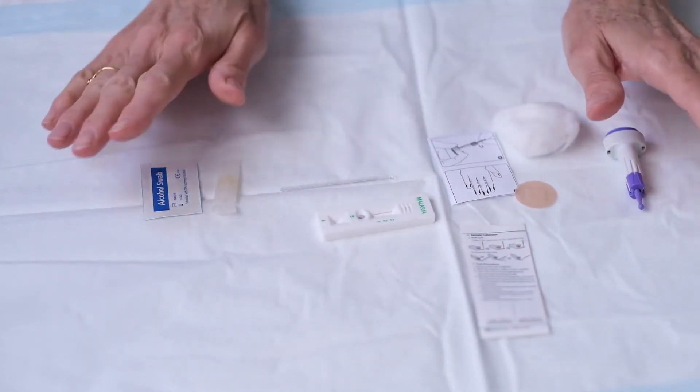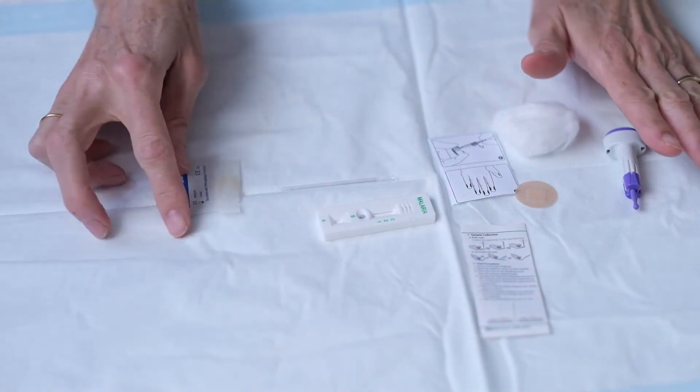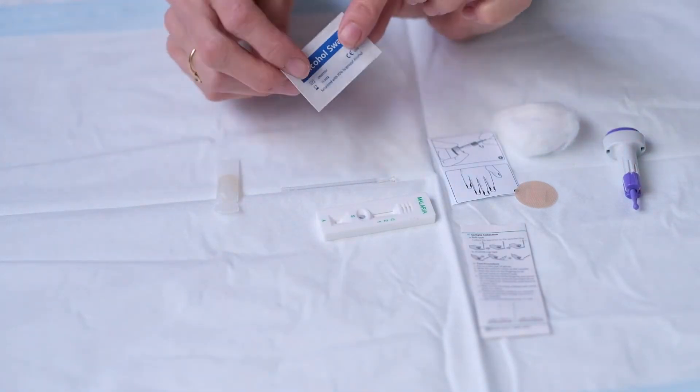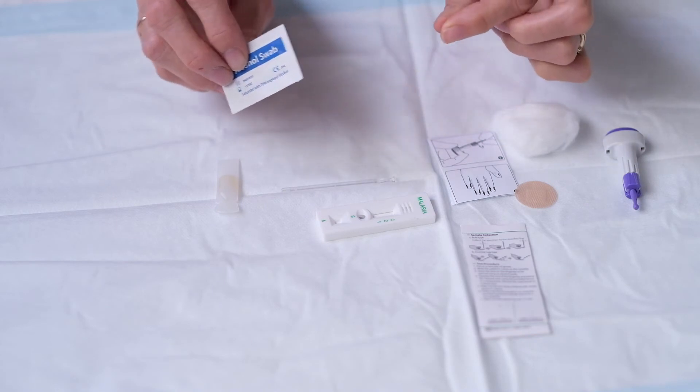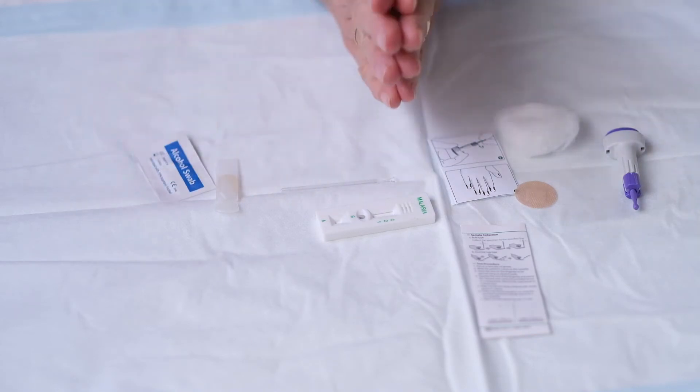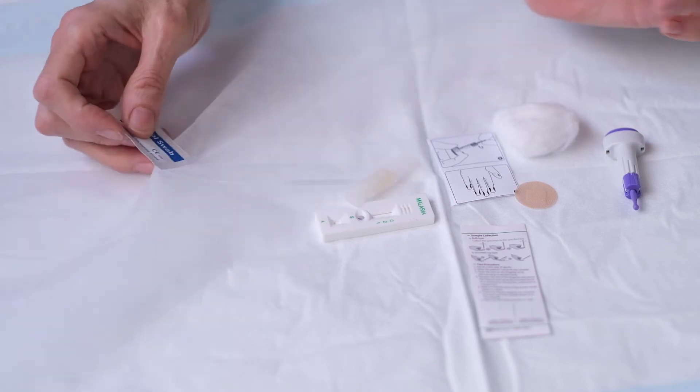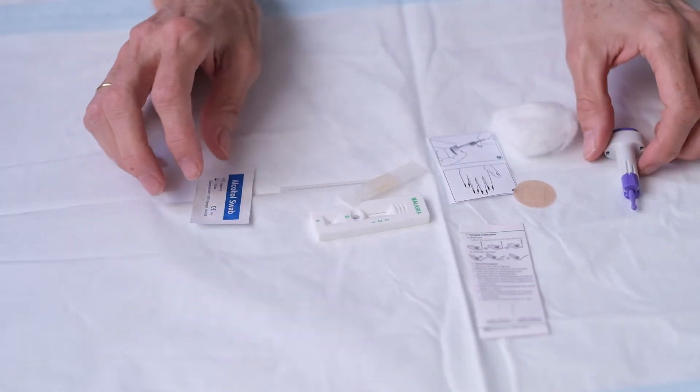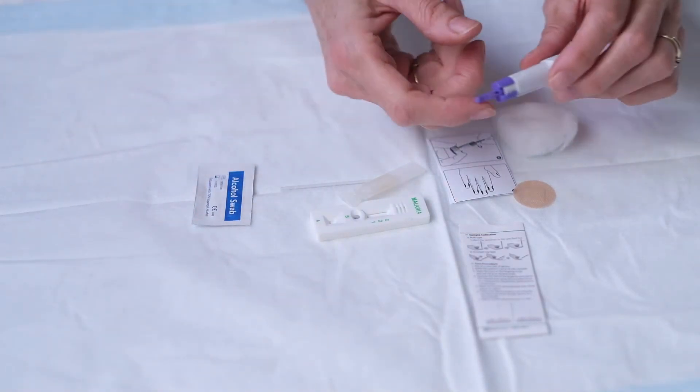So once you've got everything out, if your hand is dirty then you use the alcohol swab. If your hand is reasonably clean and you've washed your hands with soap and water beforehand, this is not perfect because it really makes the stab sting.